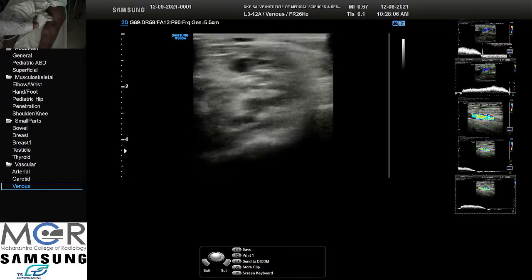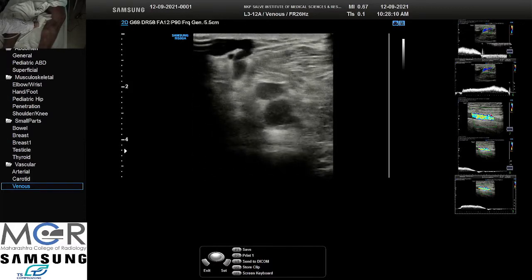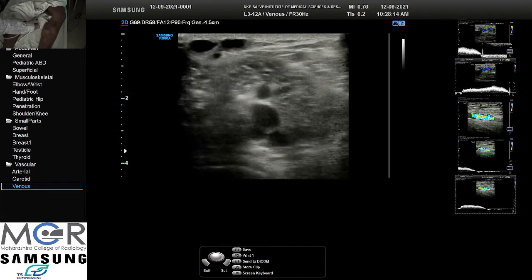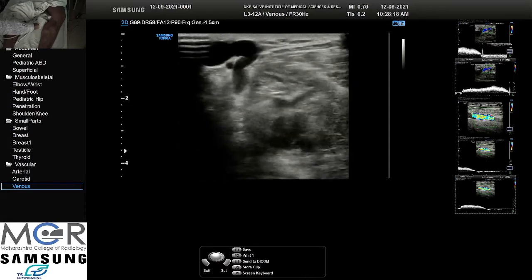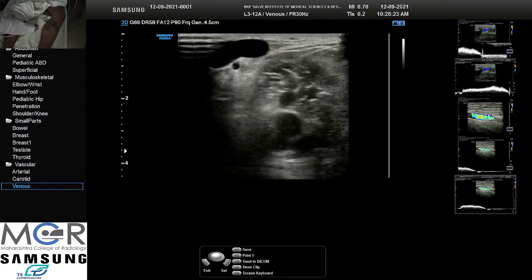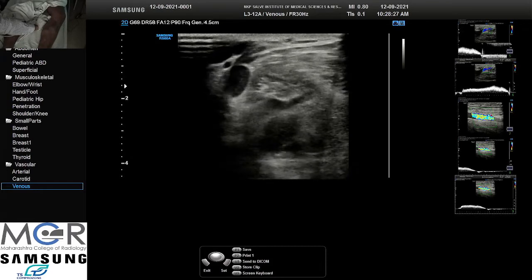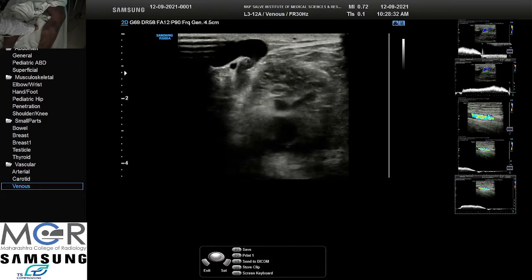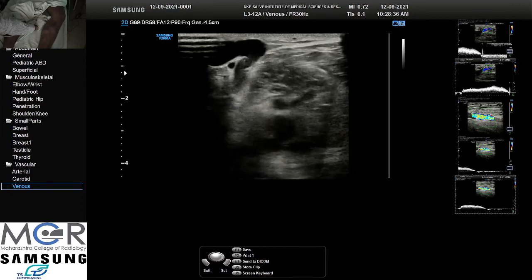Of them are in superficial plane, and here it is entering the deep plane. See that I am almost at the popliteal fossa. From medial it has gone to posterior, the superficial varicosity. That was what I was referring to. There is no definite course from where the perforator would go, or from where the varicosities would develop. So he has SFJ incompetence, and the perforator is posteriorly.